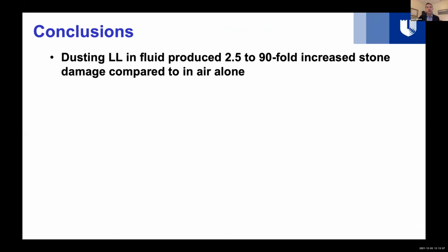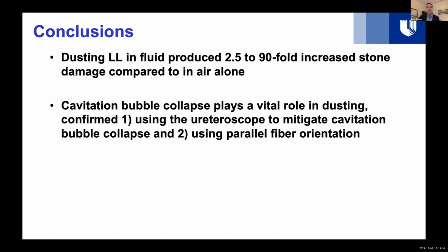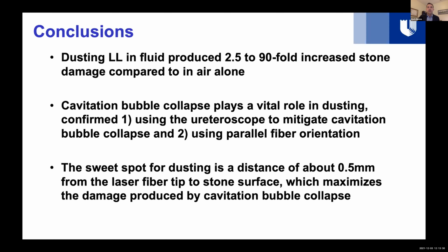So in conclusion, dusting laser lithotripsy in water produced 2.5 to 90-fold greater stone damage compared to treatment in air across various standoff distances. We propose that this is due to the vital role of cavitation bubble collapse, which was confirmed first using the ureteroscope to mitigate cavitation bubble collapse toward the stone, and then second, using a parallel fiber orientation to isolate cavitation damage. Last, the sweet spot for dusting appears to be a standoff distance of about 0.5 millimeter from the laser fiber tip to the stone surface, which also maximized the damage produced by cavitation bubble collapse.